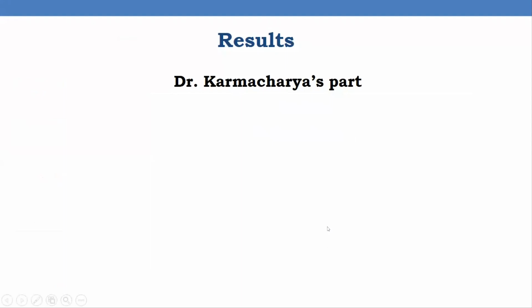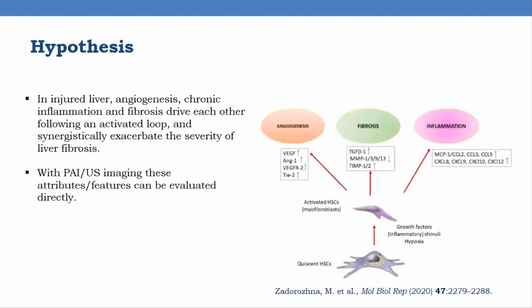Many people are using ultrasound, but mainly only the qualitative aspect of ultrasound is being explored. But here we try to explore its quantitative aspect. And also we are introducing photoacoustic imaging to visualize changes in liver fibrosis. So our underlying hypothesis is as follows.